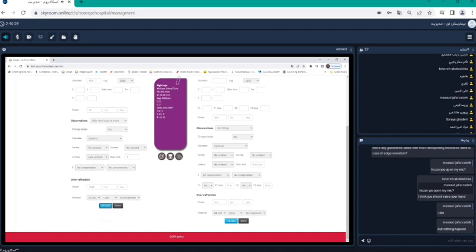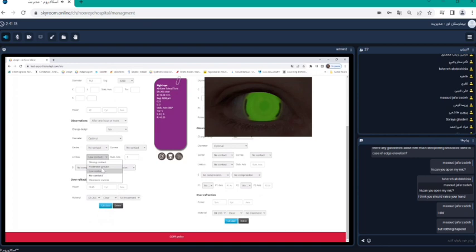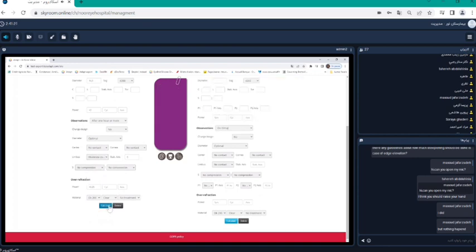And you will see here that it has given the L index plus 2. That's the answer to your question, because it was a low contact, so it ordered L plus 2. If finally you say, oh, no, I made something wrong, I had moderate contact, so calculate once again and say, oh, plus 4. If it was a strong contact, plus 6. So you can also play with the iAdapt in order to have the type of answer to the question you have in mind.